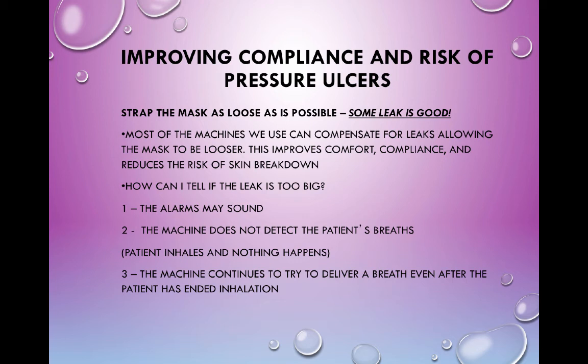You'll see patients that have never been diagnosed with sleep apnea, but you can tell that they're obstructing. Even on BiPAP, they're obstructing. So we may have to turn that expiratory pressure up and kind of figure that out.